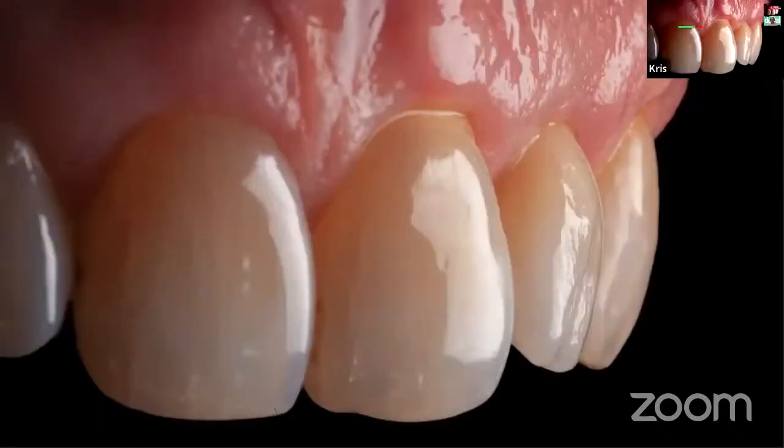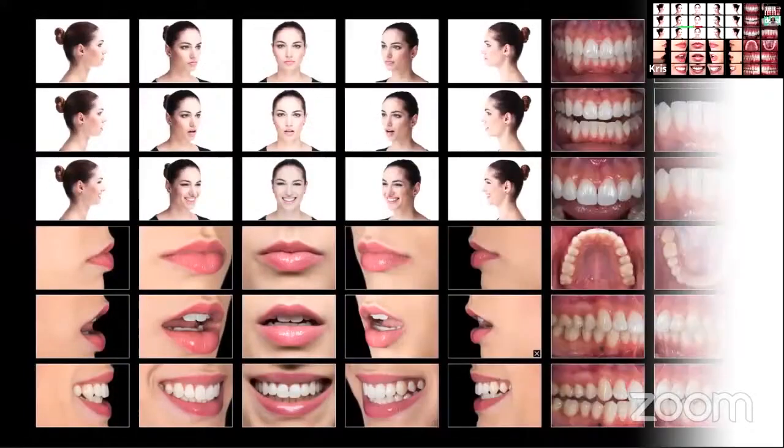Depending on the light quality and the light direction, we are able to read information about the texture from the pictures, and this is very critical, how we position this light. So whatever photography you are doing, at the end it is just a matter of understanding the light, how the light works and how the light creates this beautiful information about the texture and shape.